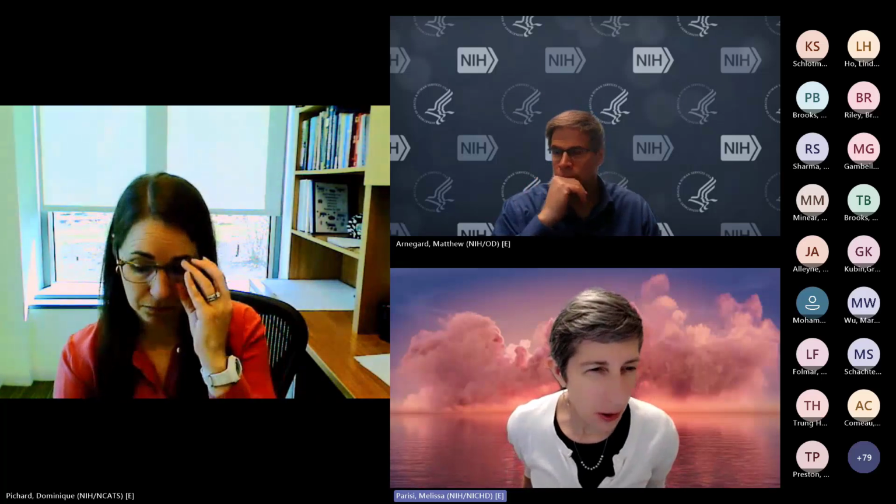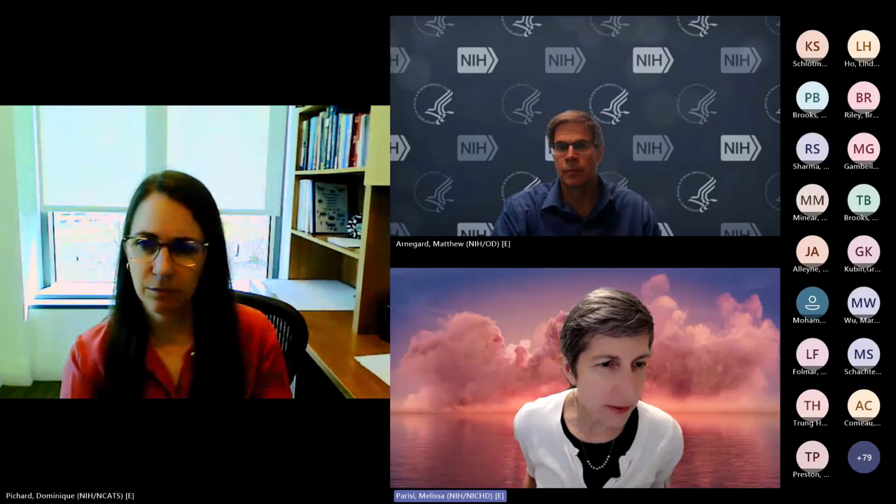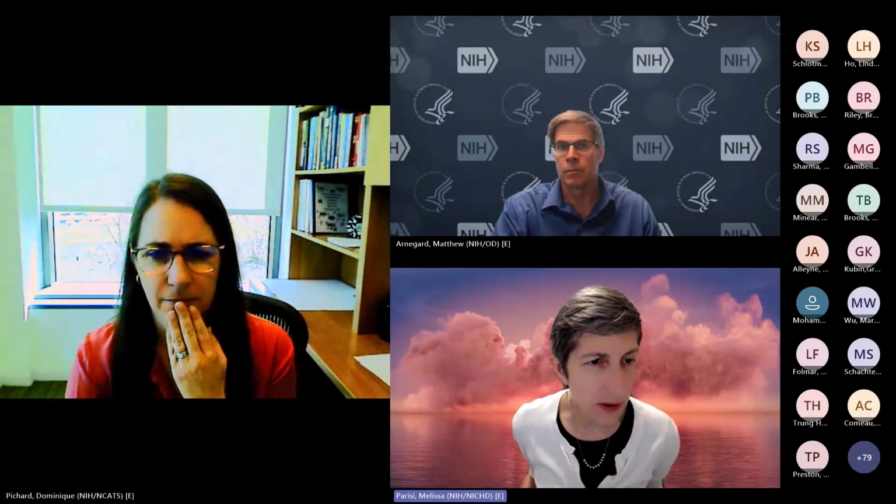So I can answer at least one of those. Again, there are several questions embedded. One of the questions was what types of variants would be reported. Our goal here is to be as definitive as possible about the variants that are reported as either pathogenic or likely pathogenic. We would not be returning variants of uncertain significance.